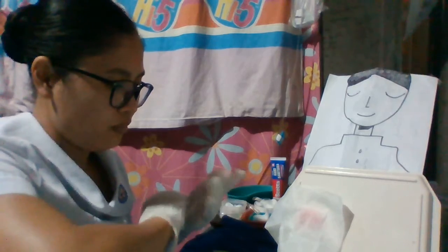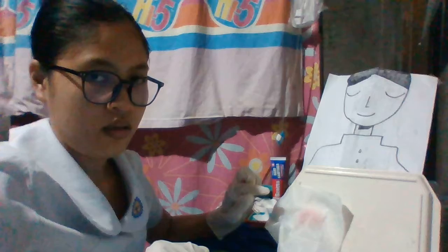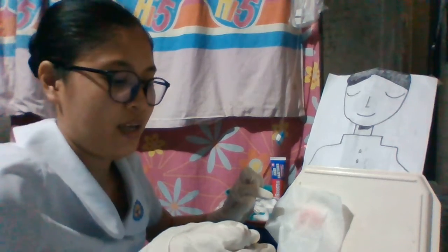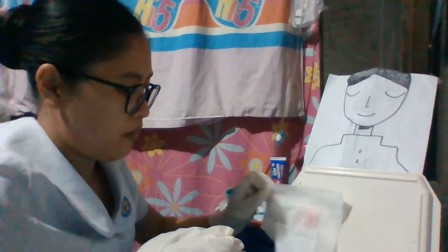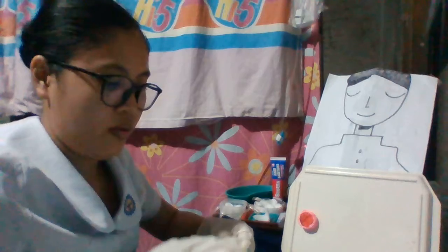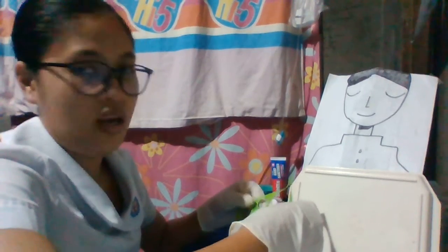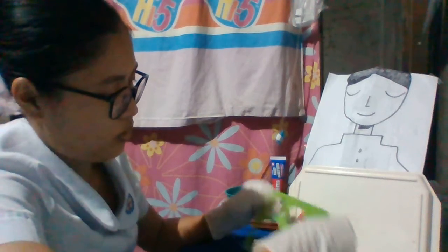Then use the guide to measure the stoma, and we're going to cut the size and opening by the guide, by putting it slightly over the actual stoma so that it will fit.